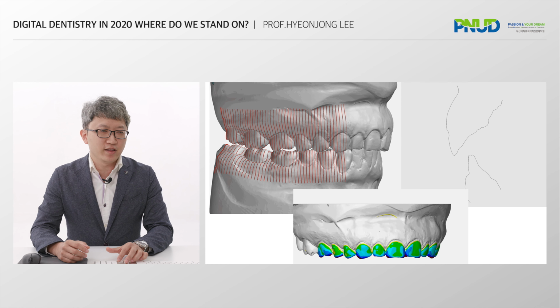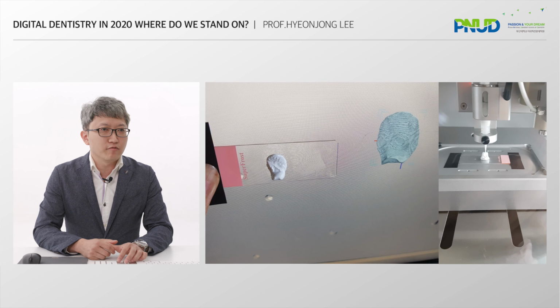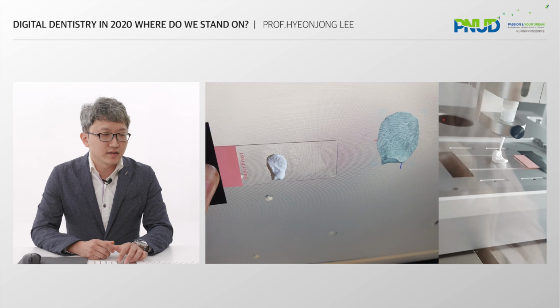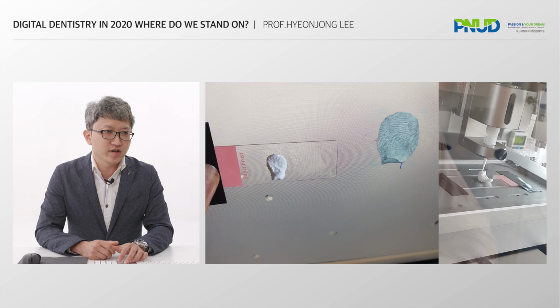We can just store them as files. And I also performed a study regarding 3D bioprinting to generate 3D customized bone or bony defect areas. There are many kinds of 3D printers actually.